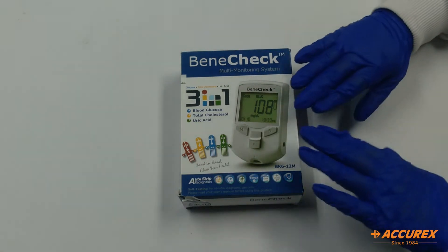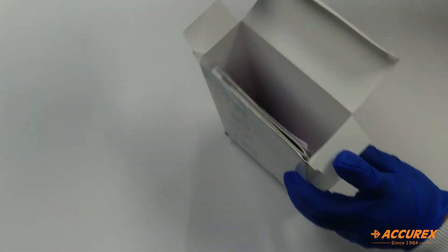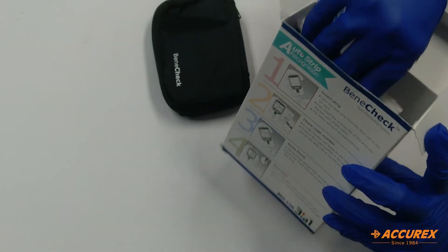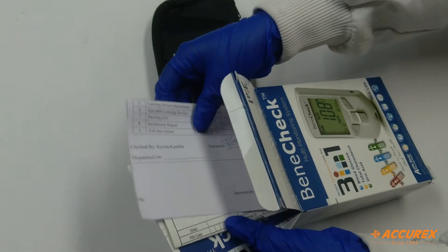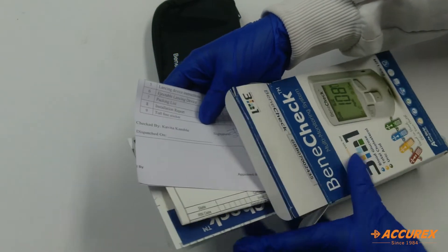First we will see what all comes with this box. Here is this black pouch and here there is all the packing list, warranty card and the user manual.